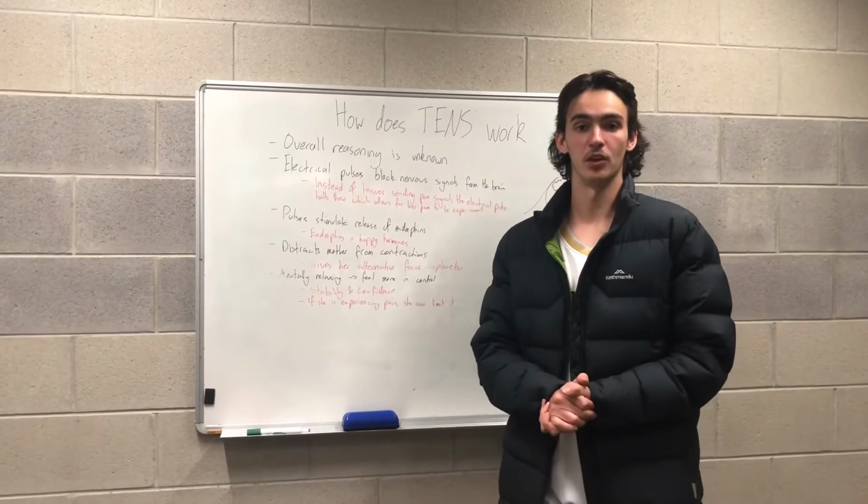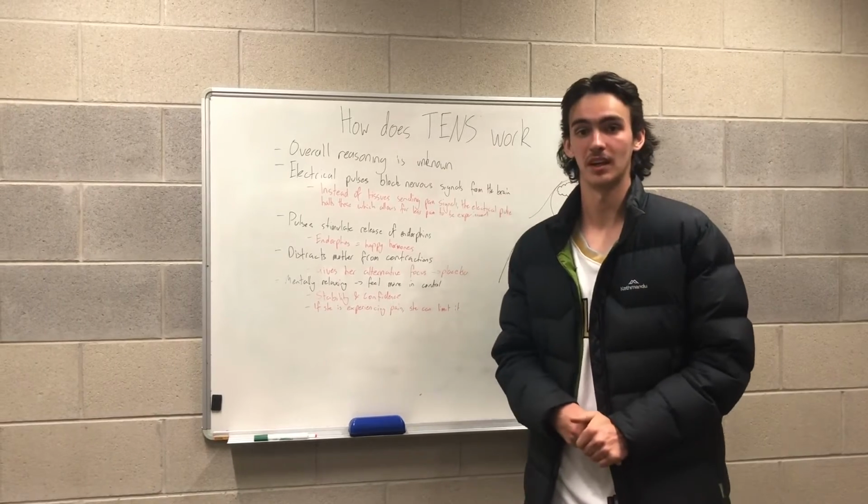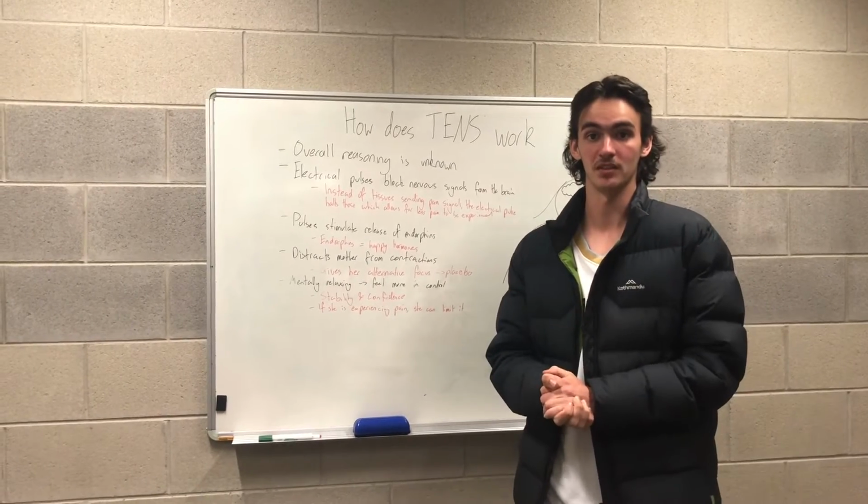So moving swiftly on, we're just going to be having a look at how the TENS actually works, in particular with labour patients.